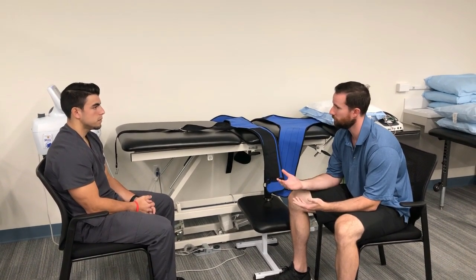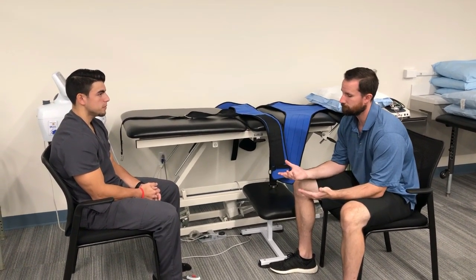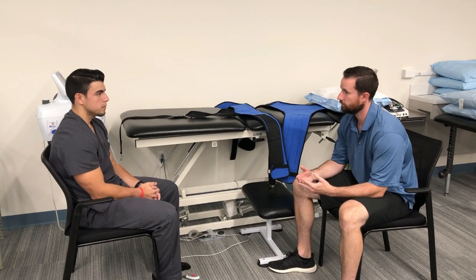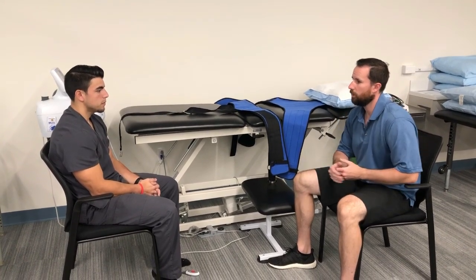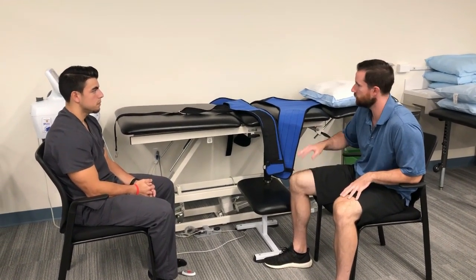You don't have COPD, you're not pregnant, you're not claustrophobic. Nope. You haven't had any recent spinal surgeries like a discectomy. You don't have OA or osteopenia. What about history of steroid use? Nope. Okay. So now that we've cleared you on the contraindications and precautions, we can go ahead and get you set up.